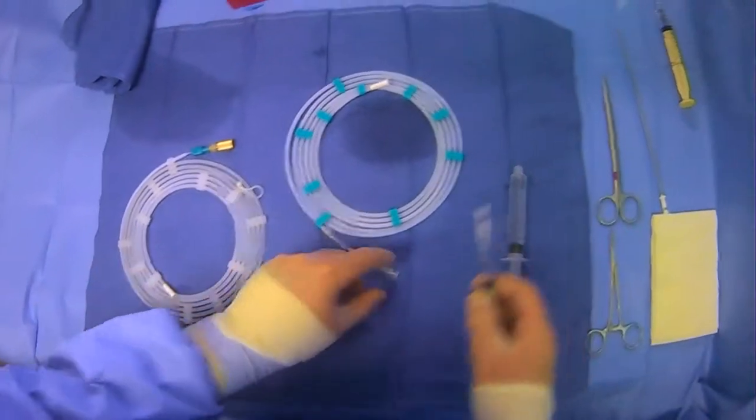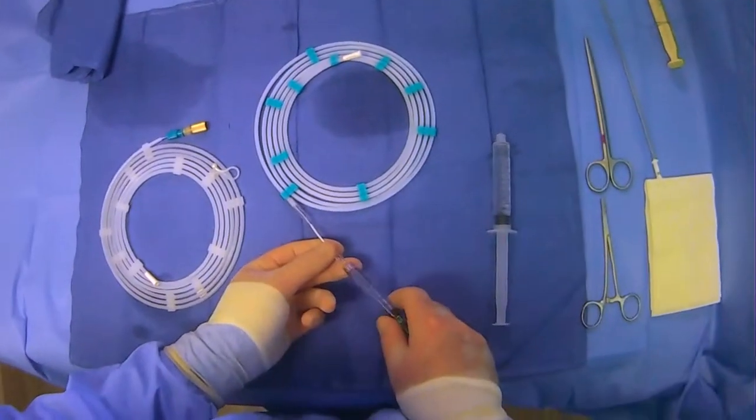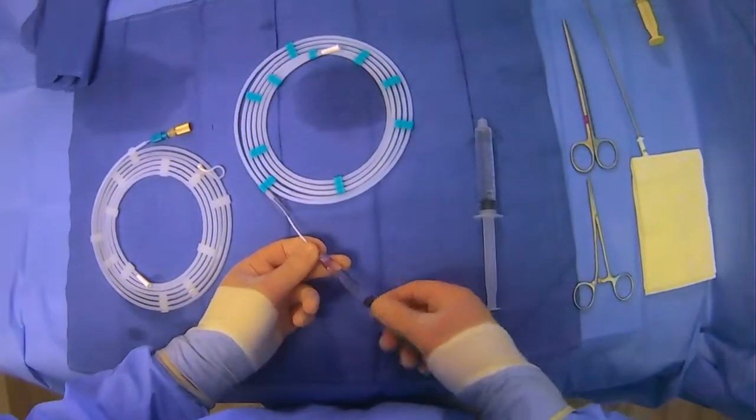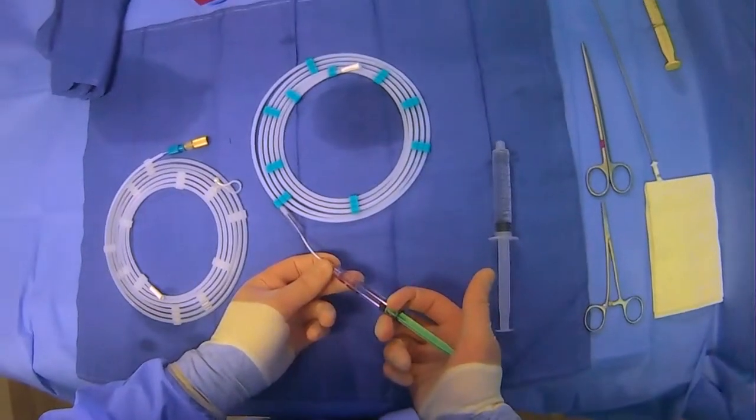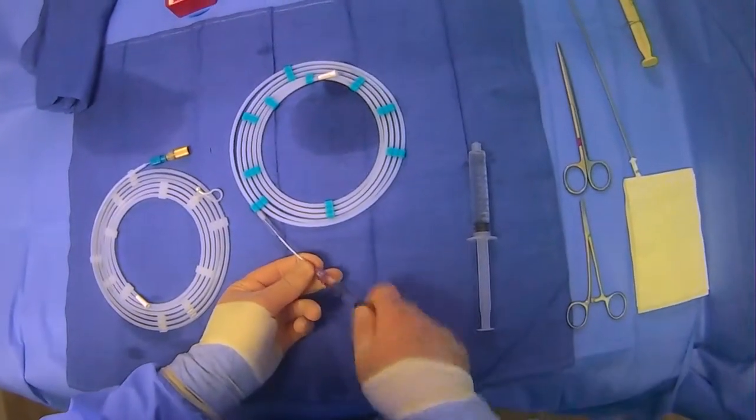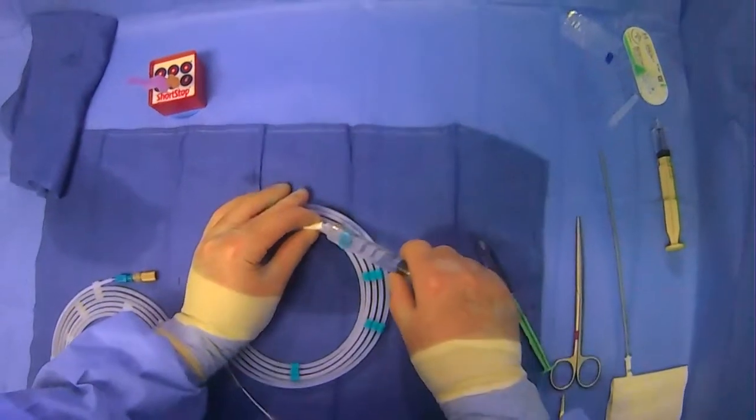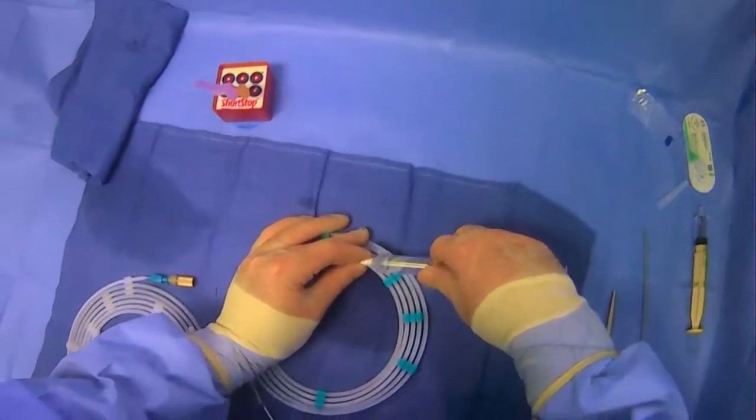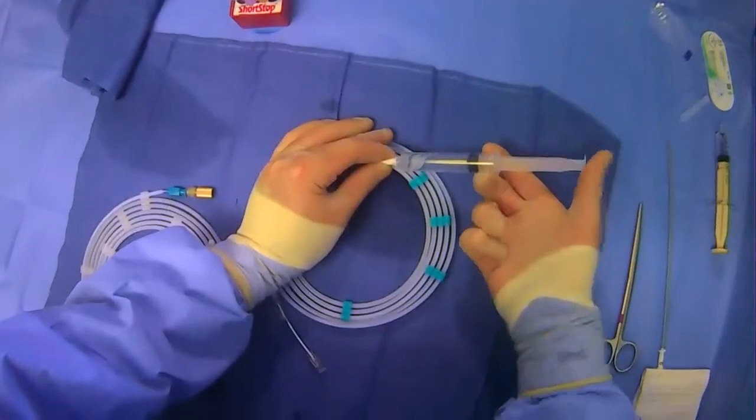First step is to flush things. When flushing microcatheters, you have to use a smaller syringe. This is a 3cc medallion syringe because the other syringes can't generate enough pressure. So you can use the smaller syringe to flush the inside of the catheter. You can use a larger syringe to flush the outside from the other end.